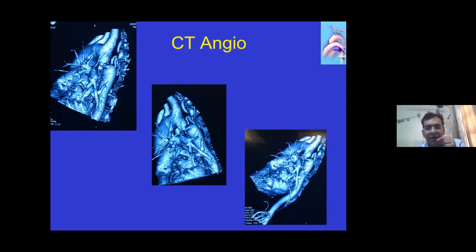And so a clinical suspicion of coarctation was supported by the echocardiography, which showed that LVH is significant, and they underwent a CT angio. Look at this CT, it's a case of severe coarctation. There is a proximal segment. There is a narrow segment which is a bit tortuous, and distal, in a different plane.